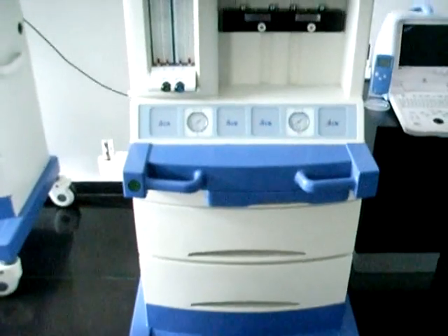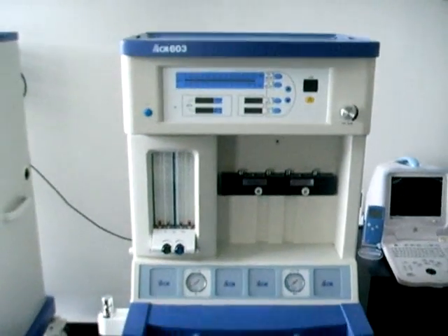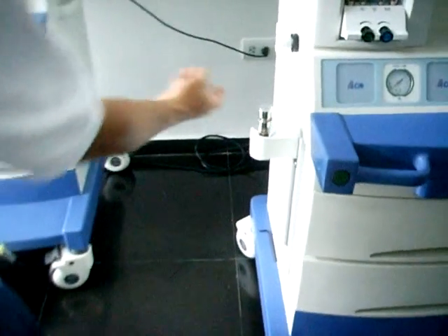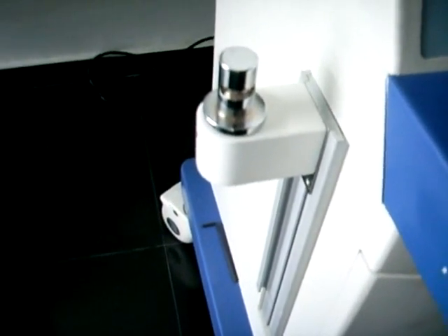Vamos a proceder a realizar la instalación del canister en la máquina de anestesia ACM603. Para su instalación debemos ubicar el lugar donde este será colocado, como se observa en el video. Tomamos el canister y ubicamos el orificio en donde este será colocado.